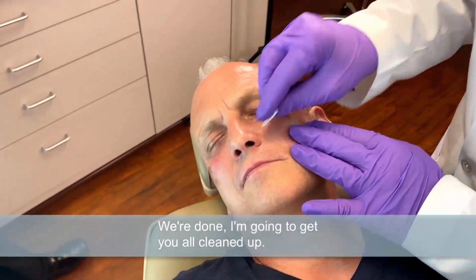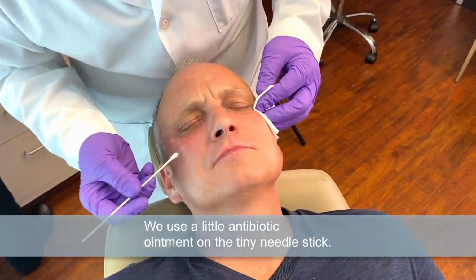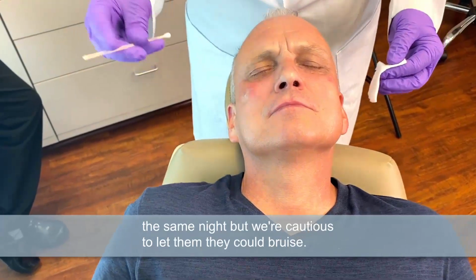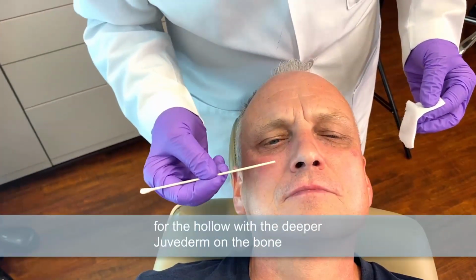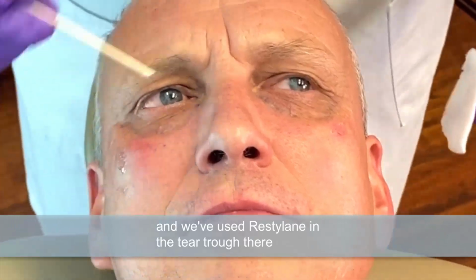We're done. I'm going to get you all cleaned up. You did great. Just doing a little massage here to make sure everything's as smooth as possible. We use a little antibiotic ointment on a tiny needle stick. Most people, like I say, can probably go to dinner the same night, but we're cautious to let them know they could bruise. So what we've done here is we've filled right here for the hollow with a deeper Juvederm on the bone, and we've used Restylane in the tear trough there on both sides.